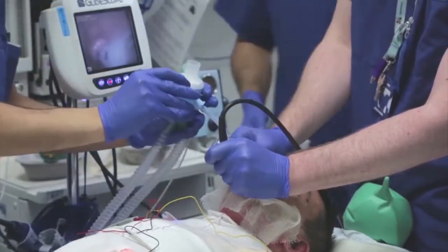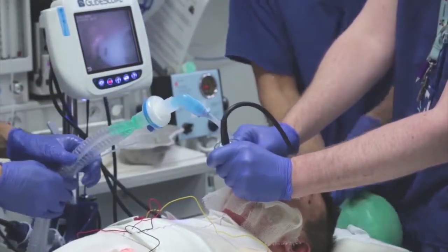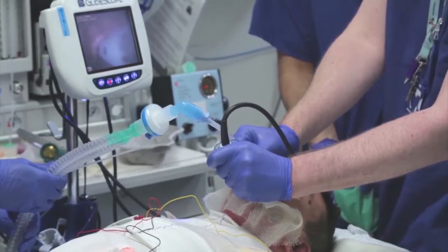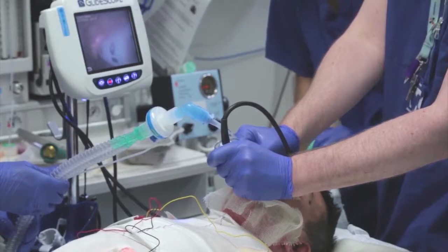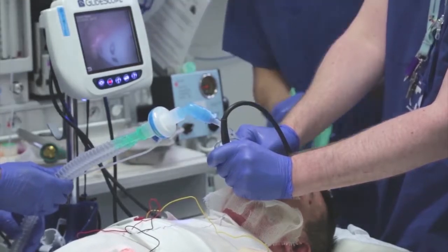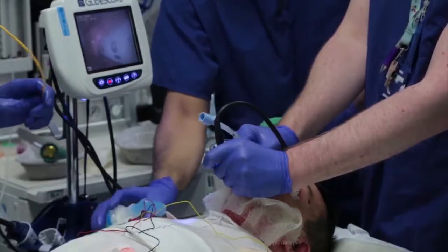There is a large leak around the tube when attempting to ventilate, shown here by the bubbles appearing around the endotracheal tube. Our practice is to place an effective endotracheal tube for the patient's ventilation, rather than what is traditionally described, which is to choose half a size smaller than estimated by age.